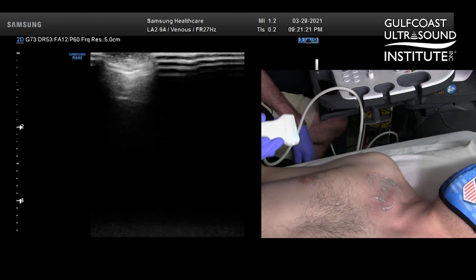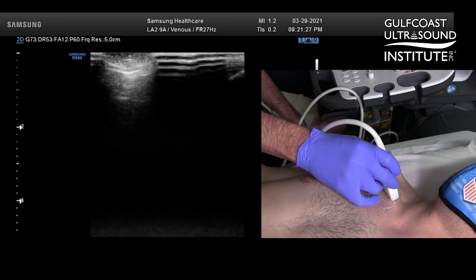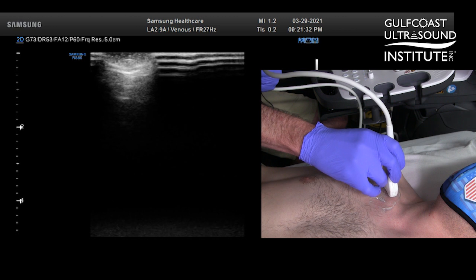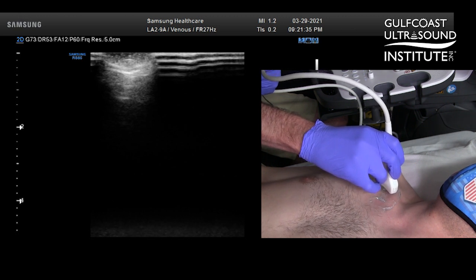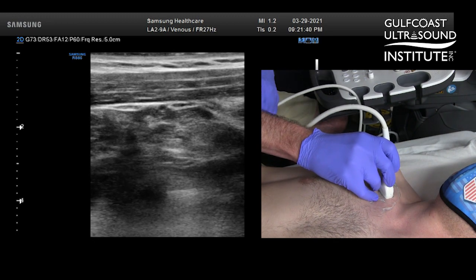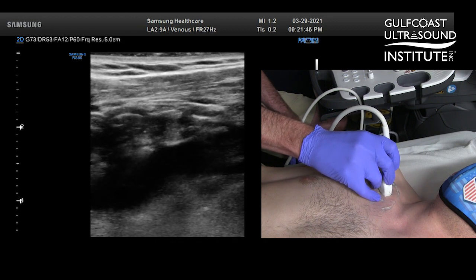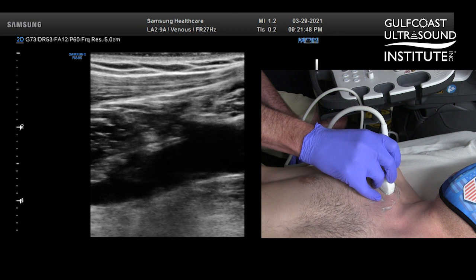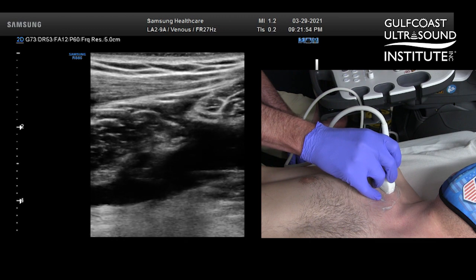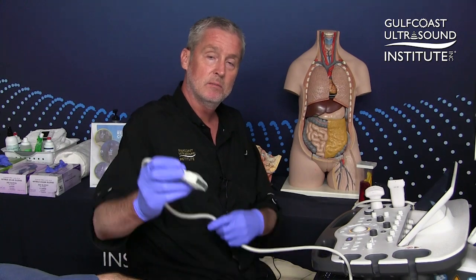The same principle applies if you're doing an ultrasound guided vascular access procedure. If you prefer the indicator to be facing away from you, same thing will happen — you'll still rotate the transducer 10 or 20 degrees inferior or toward the patient's axillary region, and that'll put you in plane with that vessel. So that's my hot tip for today. Give it a try.